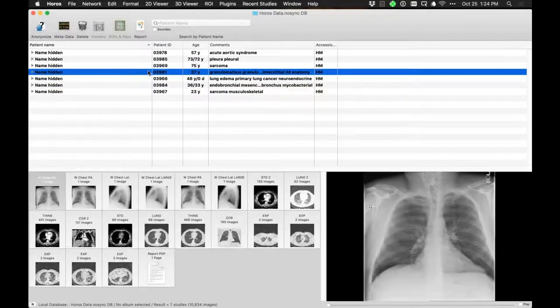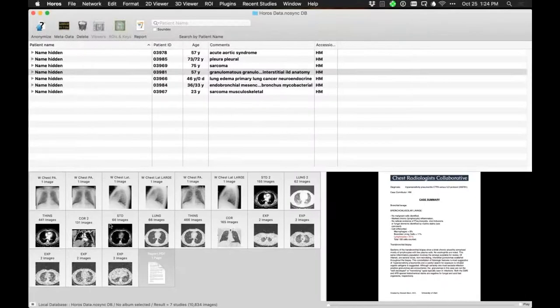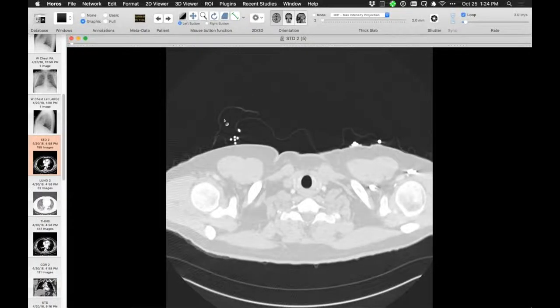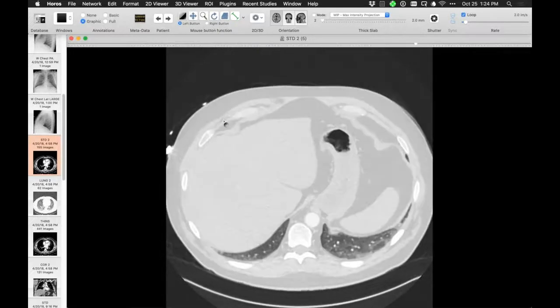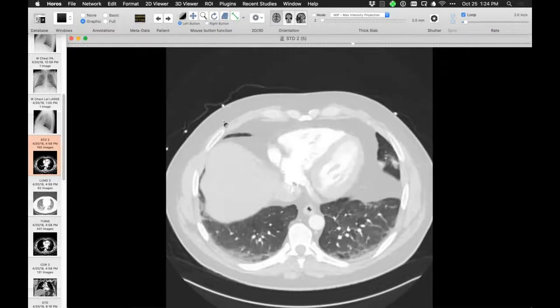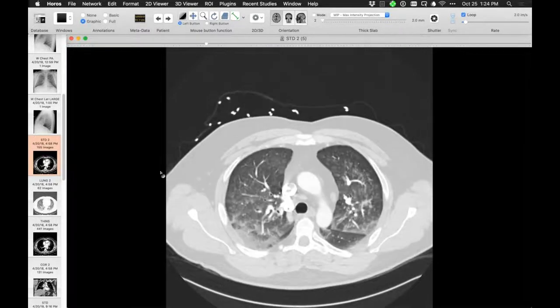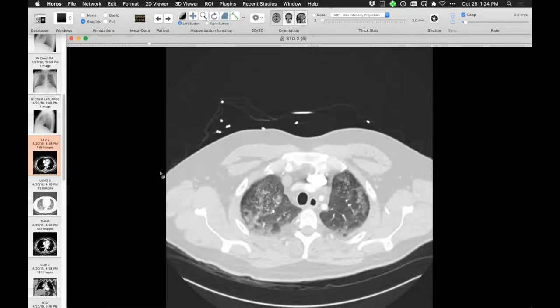Here is a really informative case. I'm sure you've all been in a situation where someone has ordered a PE study, but asked can you also evaluate the patient for interstitial lung disease at the same time? The answer is something like a qualified yes. Of course if you have a patient with extensive abnormalities of interstitial fibrosis — reticulation, honeycombing, traction bronchiectasis — yes, we can see that. But broadly conceived, it's not a good idea otherwise to try and define interstitial lung disease.